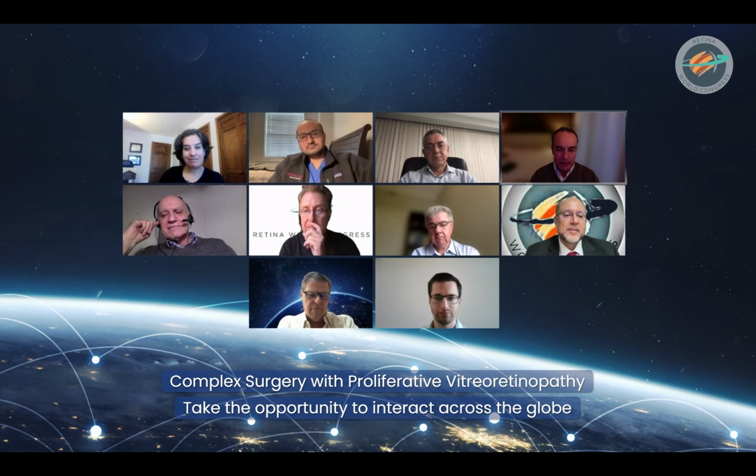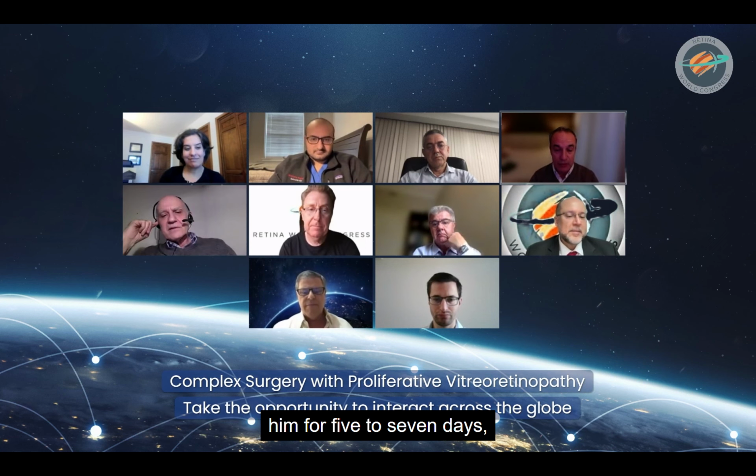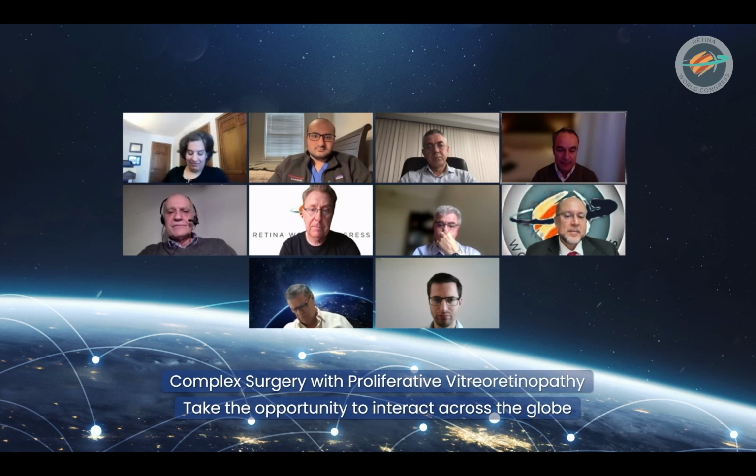It does the work. So did you posture him? Yes, of course. Strictly posturing for 5 to 7 days, 24 hours per day. Okay.